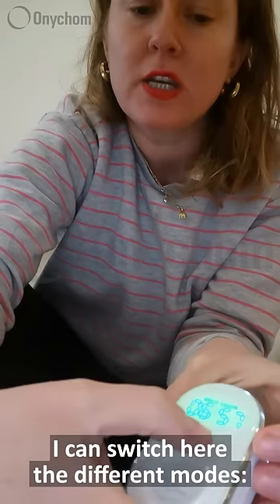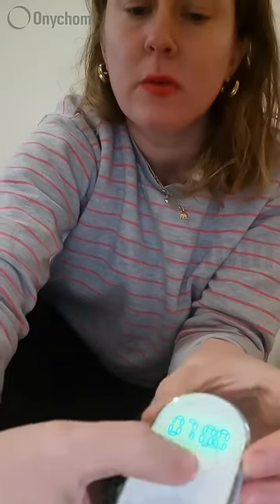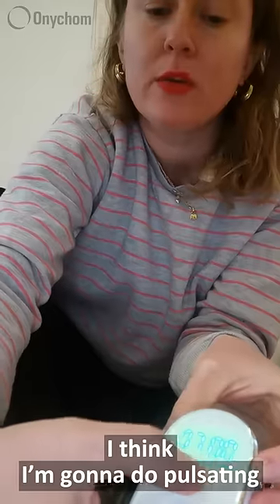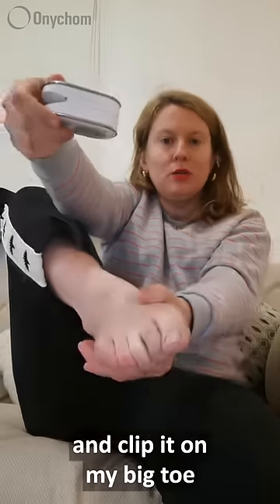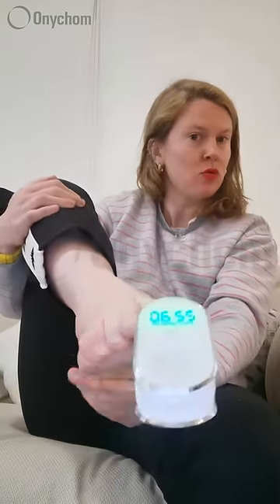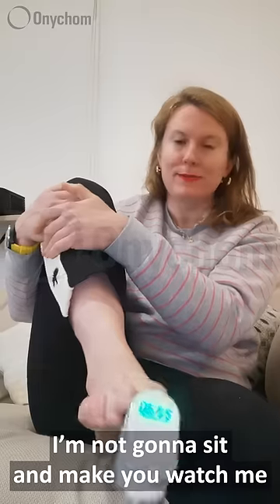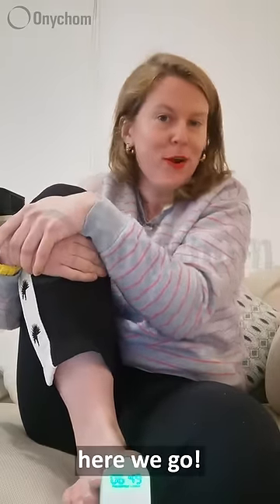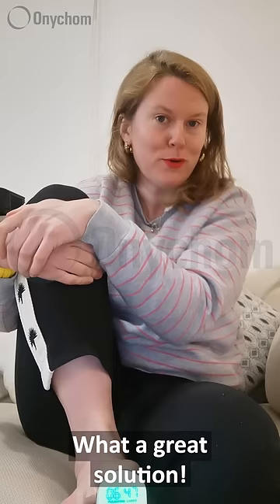I can switch here between the different modes — pulsating laser or cold laser. I think I want to do pulsating. So let's do that and clip it on to my big toe. And here we will be for seven minutes. I'm not going to make you watch me for seven minutes, but yeah, here we go. What a great solution. Thank you for checking in and have a lovely day.